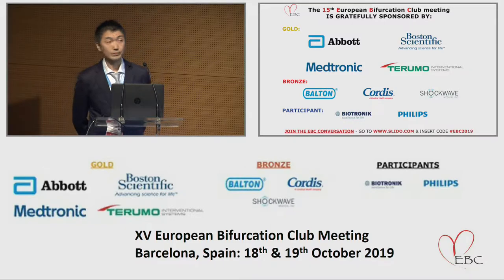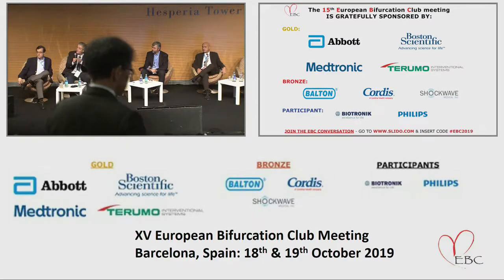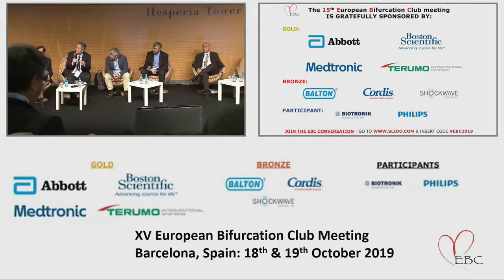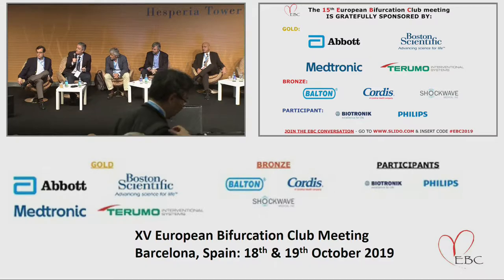Dr. Mitomo, congratulations. Nice presentation. I'll go to the computational flow dynamic part of the presentation. You show improvement in flow both with POT isolated, but also with KBT. Since kissing balloon is the only technique that can put the carina in the focus, in the center, we were expecting better improvement in flow pattern with KBT compared to POT alone.